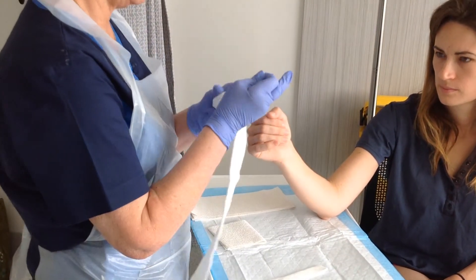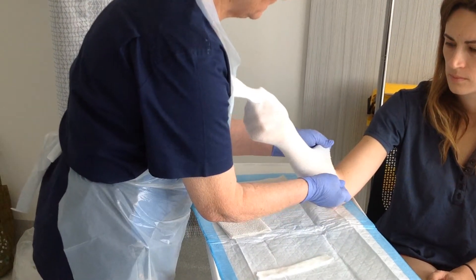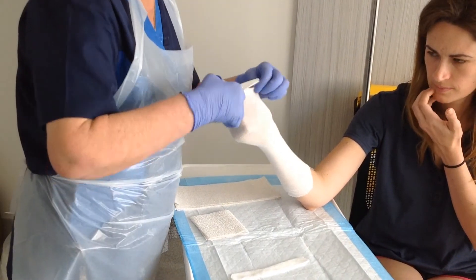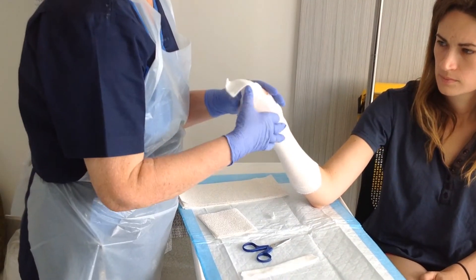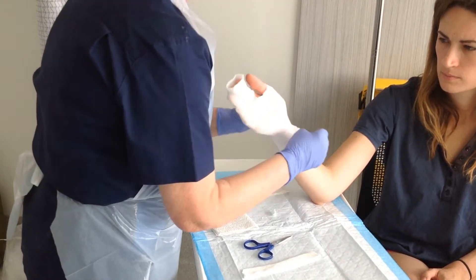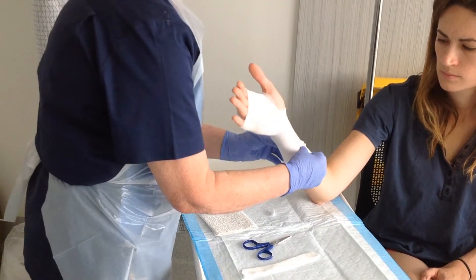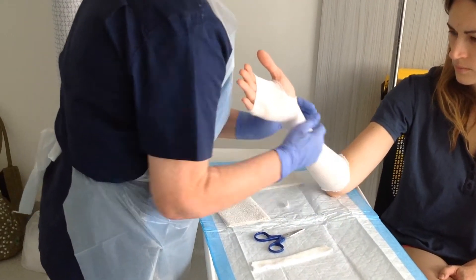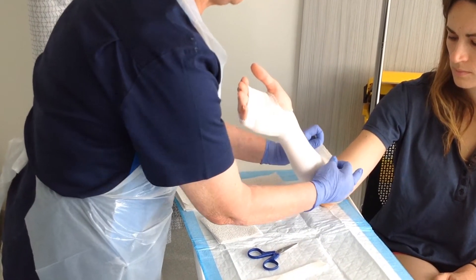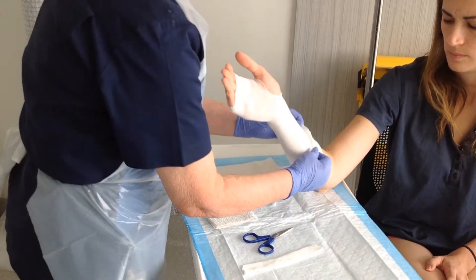We'll apply the stockingette first. It goes down the arm — just go so far down the arm; don't take it all the way to the end just yet. Pull that out. Get the patient to straighten their fingers and then pull the thumb over. Bring that back and slide it down. Watch you don't get it too tight in this web space here — it becomes uncomfortable. When we get to our edges that we're going to fold over, it's about three finger widths. So that's the fold we will require.